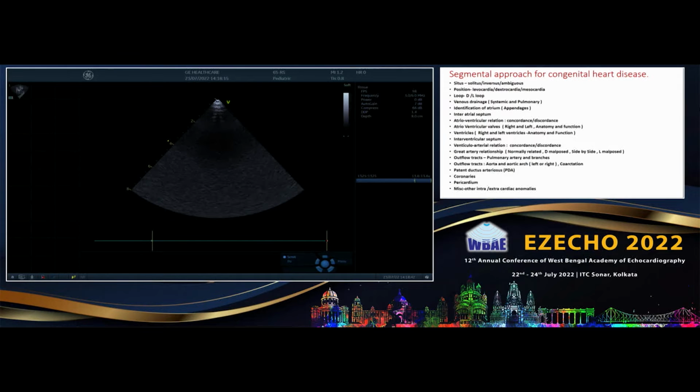One nice add by sir. This is because the sound of the murmur is quickly getting transmitted to everybody. So she will try to show the next bigger child if we can get. It will be easy.